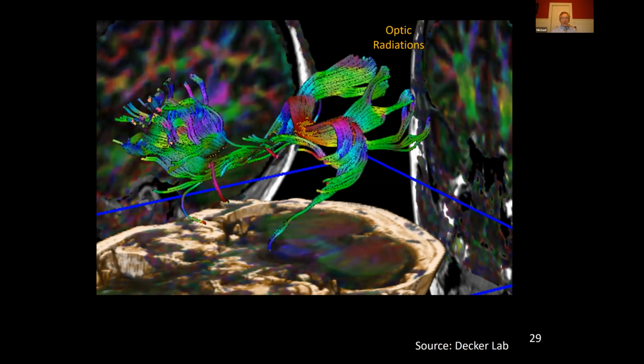Again, this was all done in our lab. And these are not standard techniques. You cannot walk down to the MRI suite and ask for diffusion tensor imaging because this is not typically done. It is used in stroke imaging just to see if there's an area of the brain where the white matter tracts are impaired, but these are not standard clinical procedures.